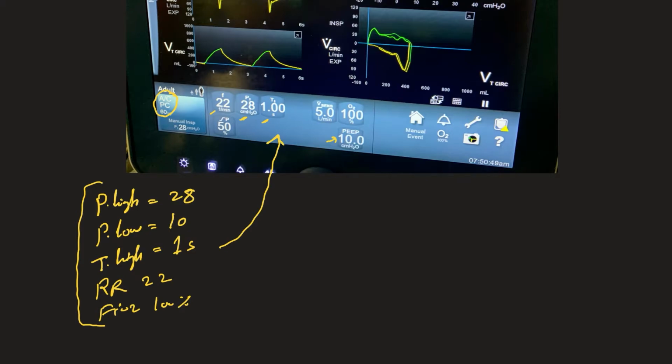So if you're going to do this, where you spend much of your respiratory cycle in expiration, not in inspiration, you better just use the conventional pressure control mode of ventilation. This is not how we want APRV to be used, because simply here, the IE ratio is not inversed. This is just a conventional mode of ventilation. So you better just go directly and use the conventional pressure control mode of ventilation, and you don't have to use APRV.